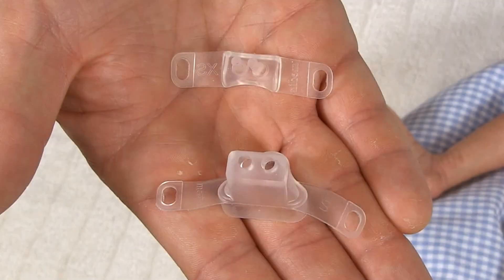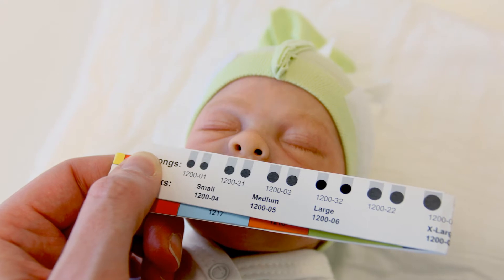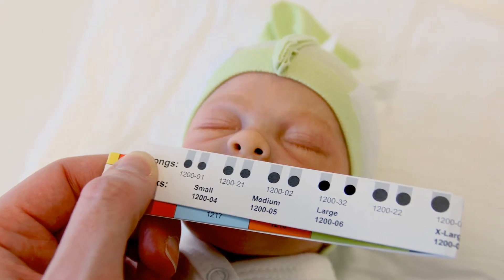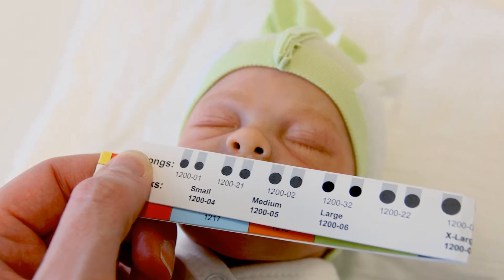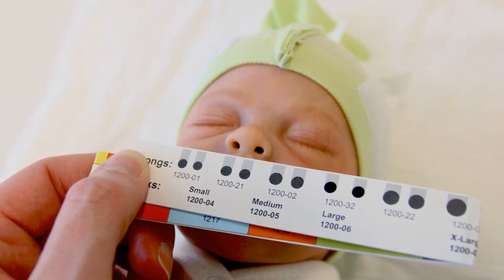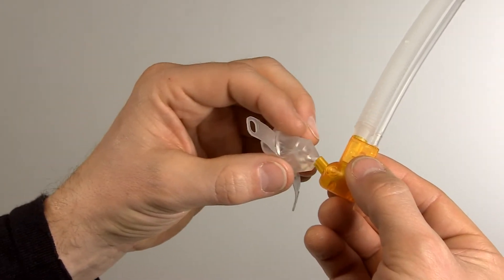You can use either a mask or prongs. In case you are using prongs, there are graphics on the side of the measurement tape to help you find the right size. Just hold the tape under the baby's nose to measure the size and width of the nostrils. In this case, we have decided to use a mask.